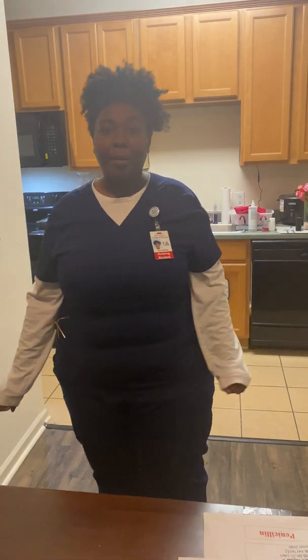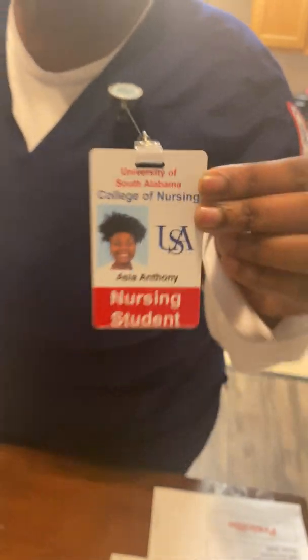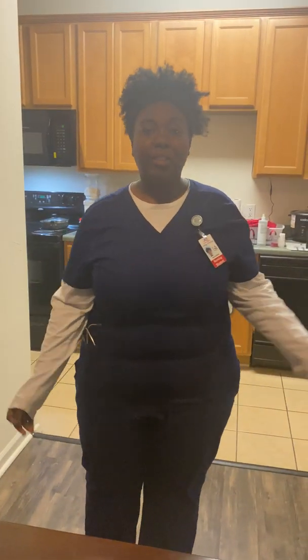Hello, my name is Asia Anthony. I'm a nursing student here at the University of South Alabama, and today I will be performing my NG checkoff. So first I'm going to have my person scan the room.